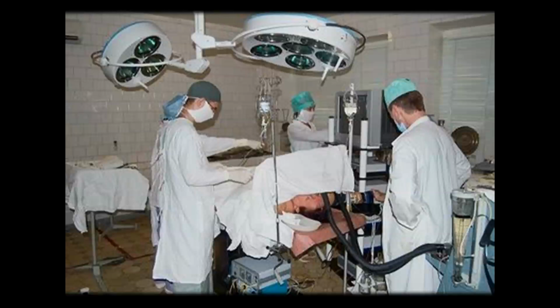These are the basic benefits of using hydrogen peroxide as a sterilizing agent. It is used mostly in biological safety cabinets and operation theatres. It is toxic and has some hazardous roles too, so we need to take care of those things into account.